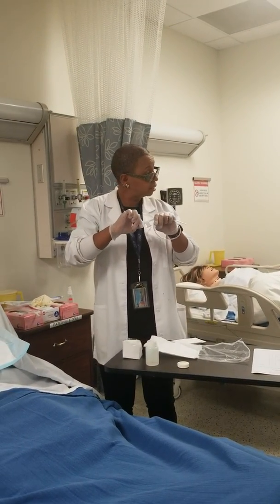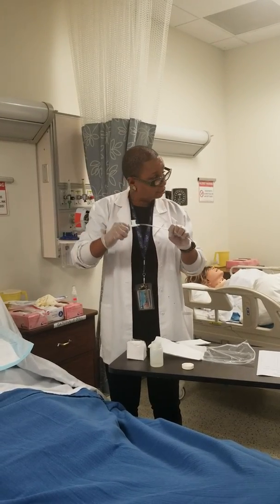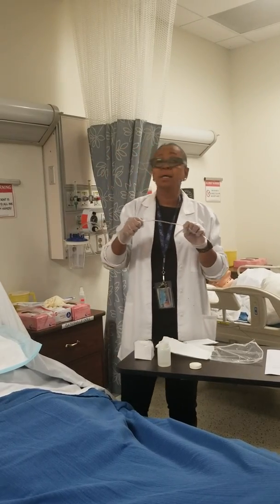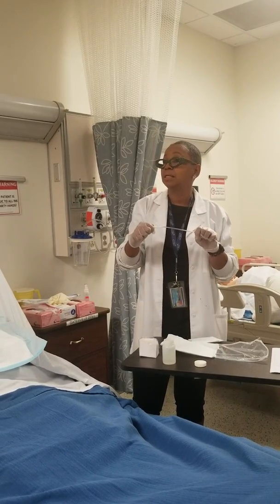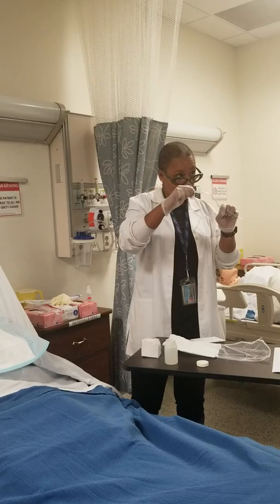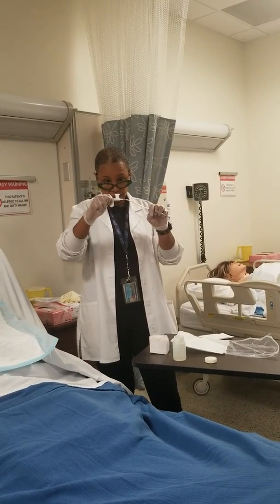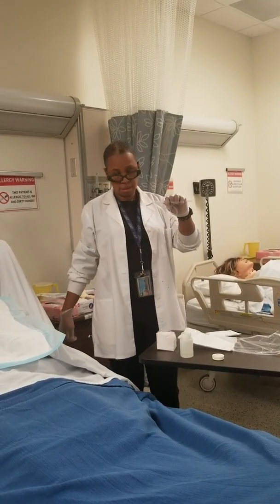Can I do this? I'll connect it to the suction. Did I break sterility? Yes. How? By grabbing the box, and then you contaminated the actual tube. Why is this contaminated? Because you touched the bottle with that hand, and you have to use the other one not to touch the bottle.